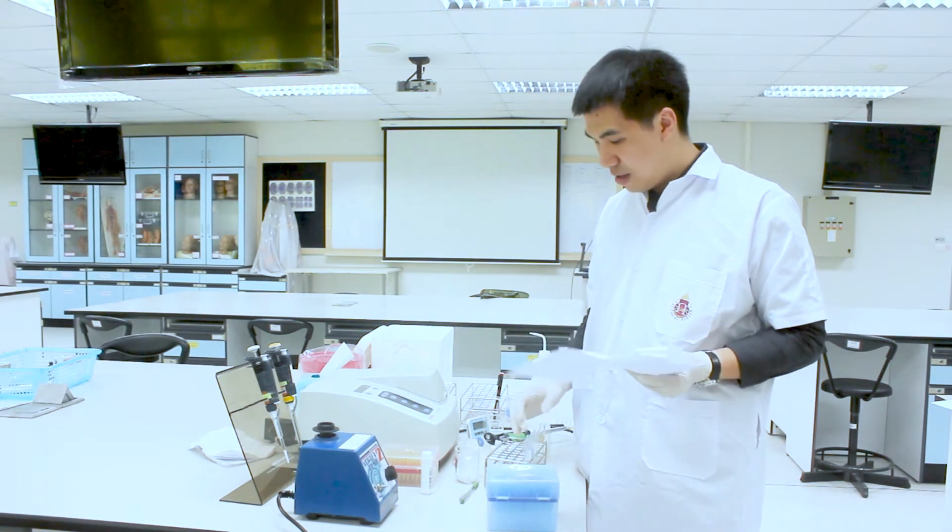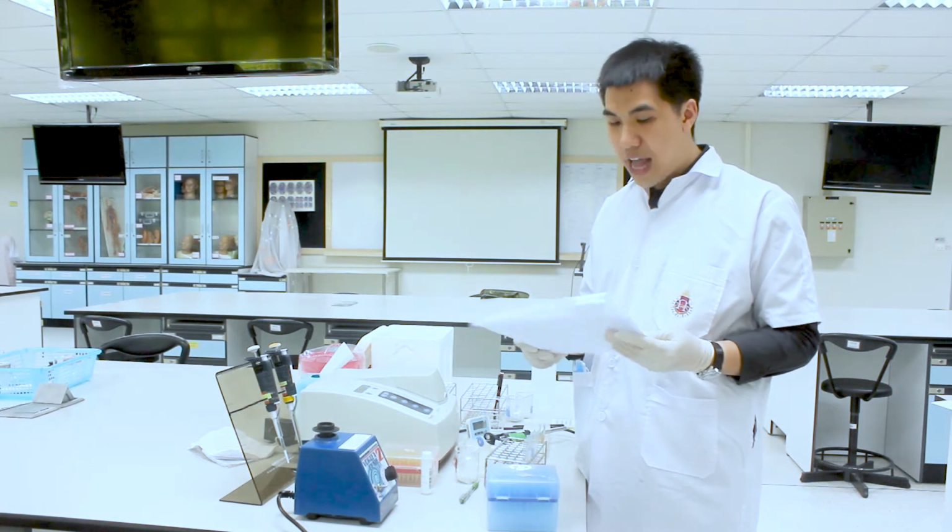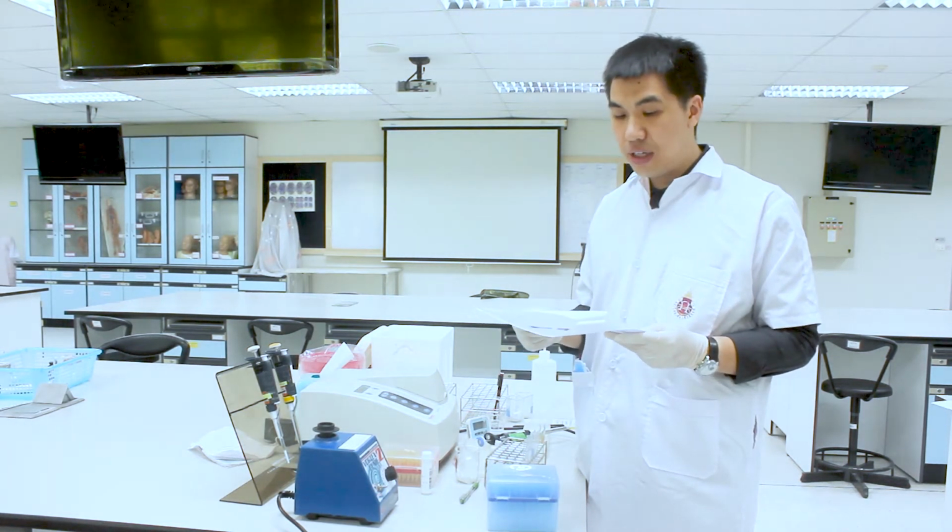The third you add abnormal control, and the fourth and fifth tubes you add unknown 1 and unknown 2. In the last tube you add the cholesterol standard or calibrator, which has a known concentration of 224 milligram per deciliter.